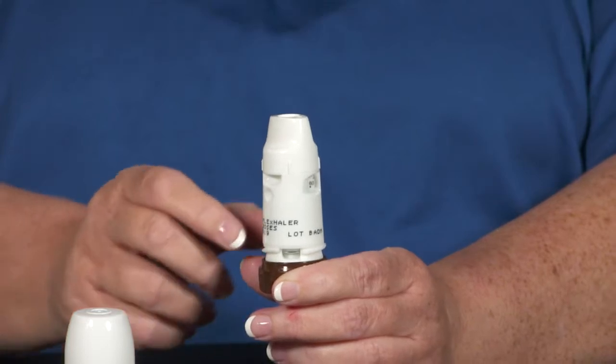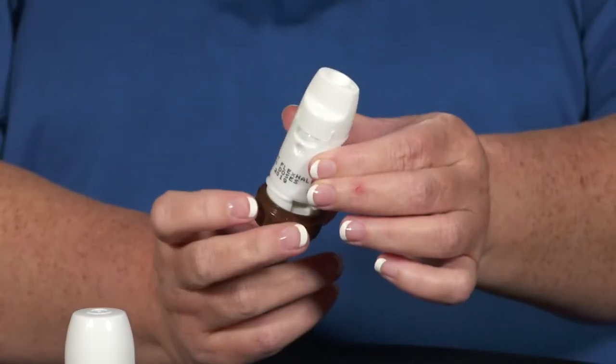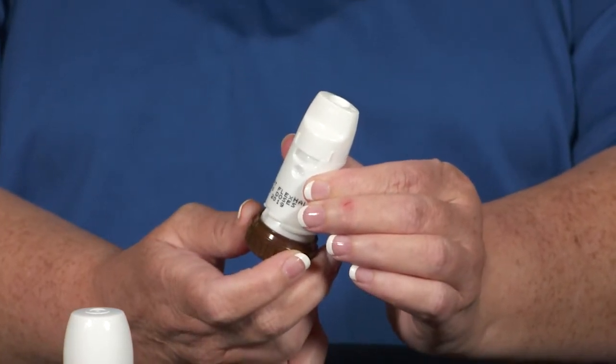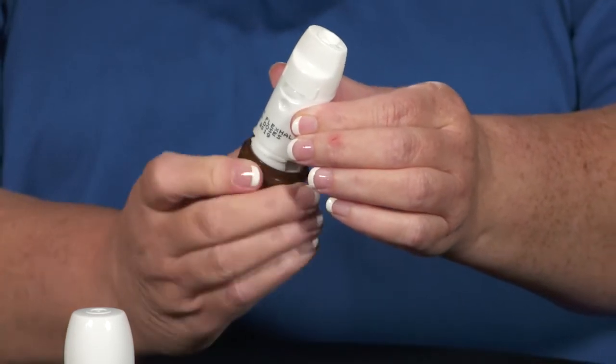Then hold the inhaler in the middle of the white part, not near the mouthpiece. Turn the bottom end of the inhaler all the way in one direction and then all the way in the other direction, making sure you hear a click like this. Priming only has to be done once, and now your Flexhaler is ready to be used.